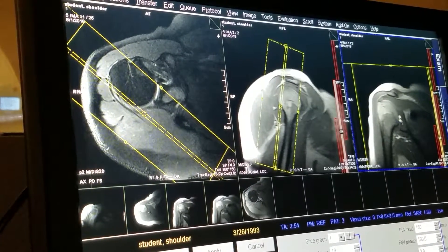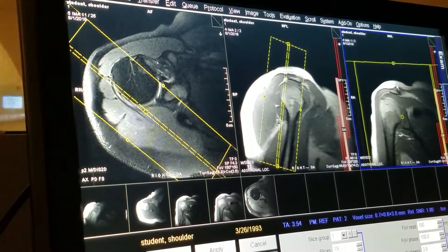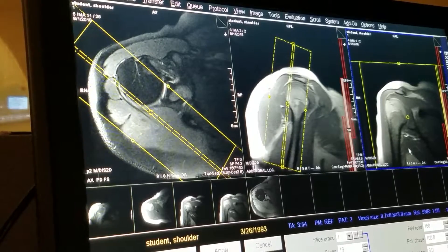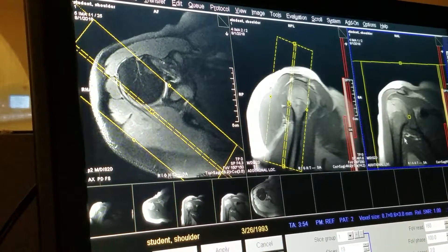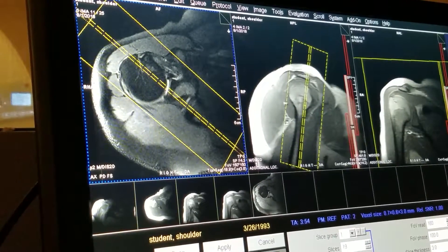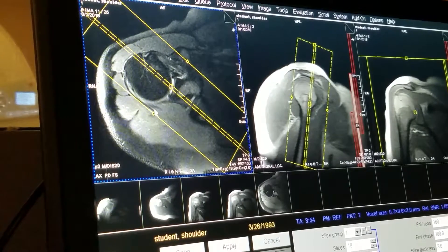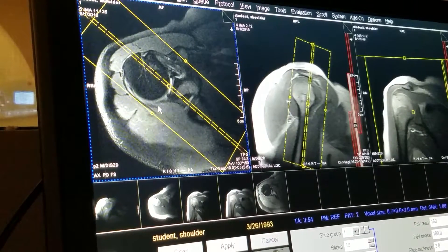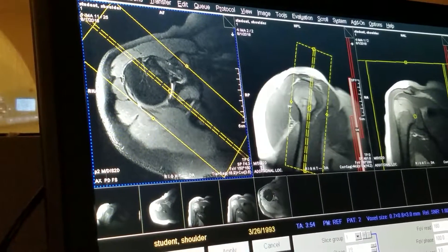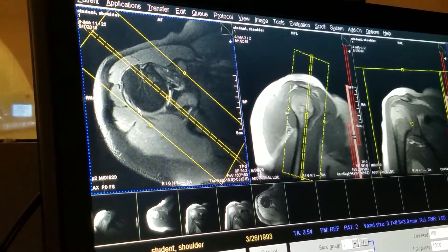I'm able to position right in the middle of the glenohumeral joint, but you obviously want to make sure that you get from above the AC joint to probably mid-axilla. So there's my field of view. Now coverage — anteriorly, you want to be to the coracoid process, and posteriorly, you want to be a few slices posterior to where you see the humerus, and that will ensure that you're covering the subscapularis muscle.